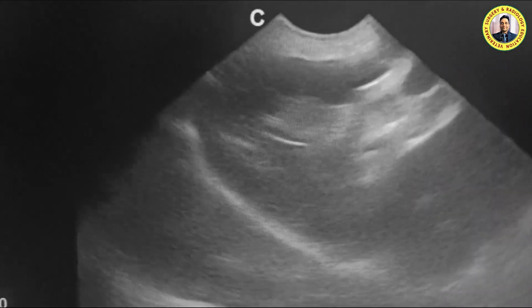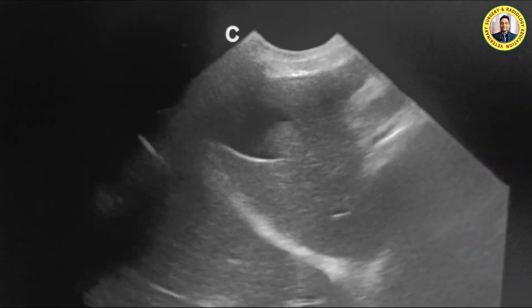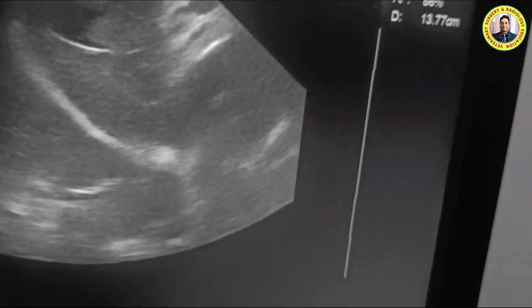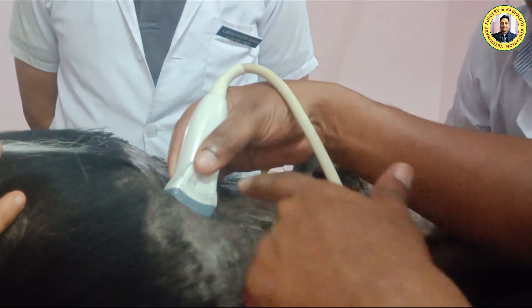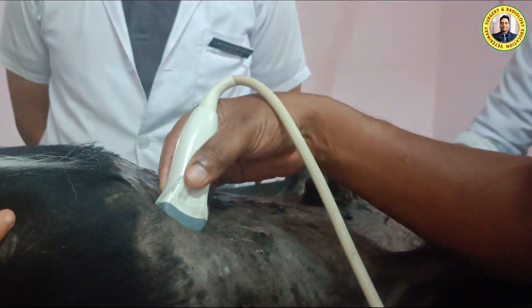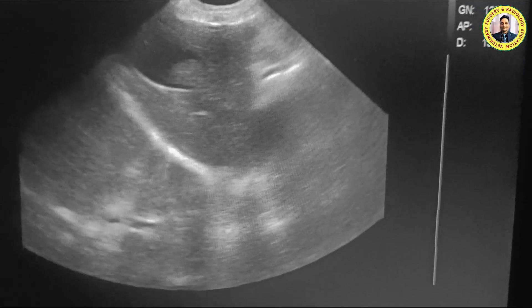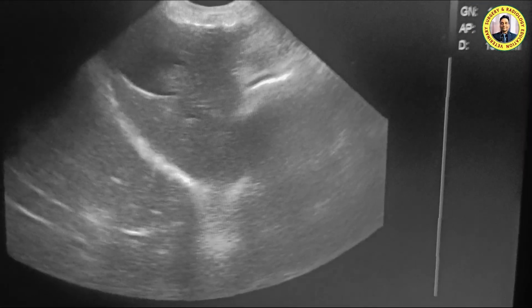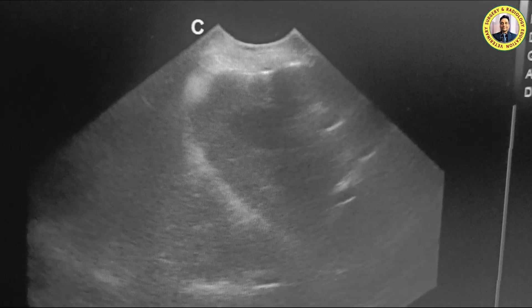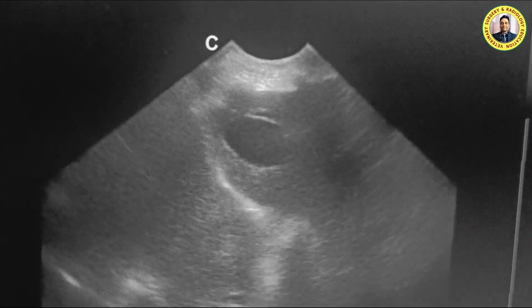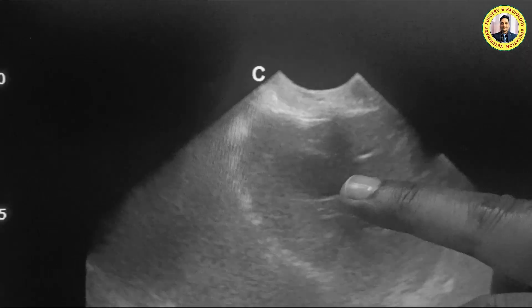Now my transducer is towards the right hypochondriac region. You can see the different structures on the monitor. This is the gallbladder — the gallbladder is visible here.